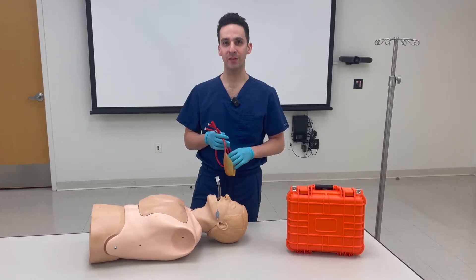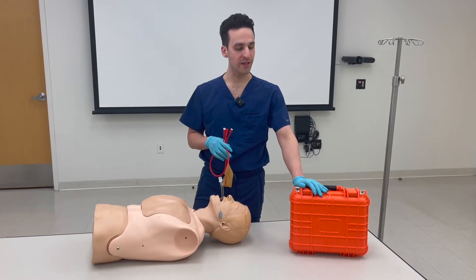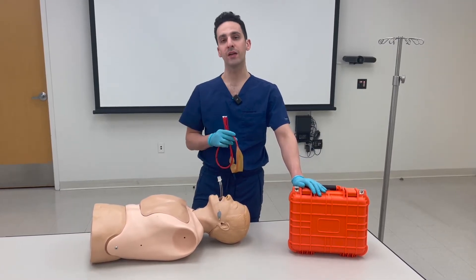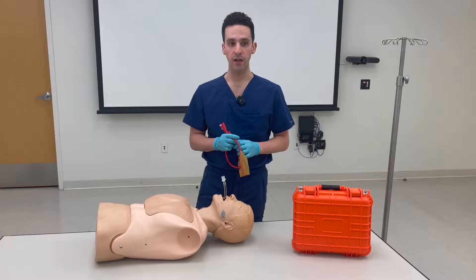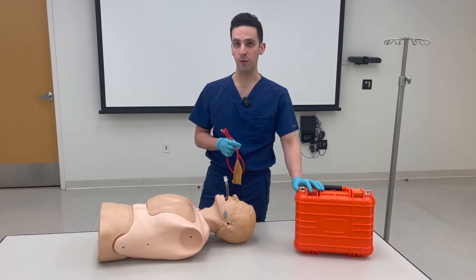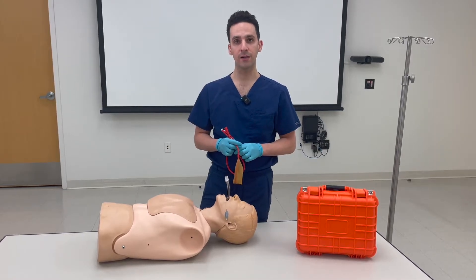Hi, my name is Aaron. I'm going to be teaching you how to place a Blakemore today. This orange box right here is your Blakemore bundle. It has everything that you need to place a Blakemore, except for the Blakemore — that's located right next to the box in a long white cardboard box. Grab that, grab a one liter bag of saline, as well as suction tubing. Call your x-ray tech; they're going to play an important role in this. Ensure that your patient is already intubated and adequately ventilating. Let's get to work.